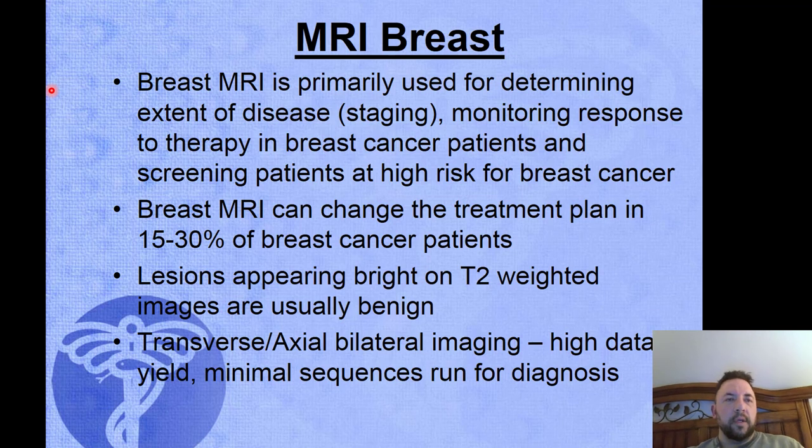As we talked about last week with prostate MR, where we use CAD, that's a rapid T1 spoiled gradient echo with fat suppression to aid and increase our tissue contrast. We do the same thing in breast, but it's more strict because we have to acquire our dynamic scan time in under a minute 20 to a minute 30, in order for the CAD computer-aided detection to perform its work in achieving the exponential time curves, basically that wash in and wash out rate.